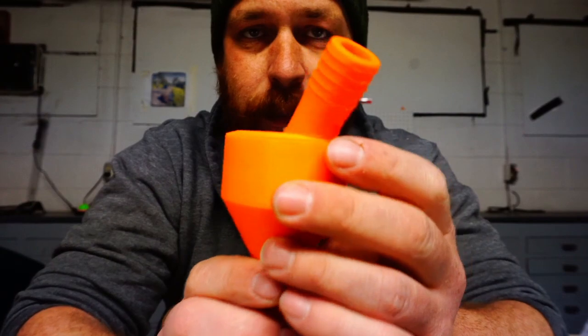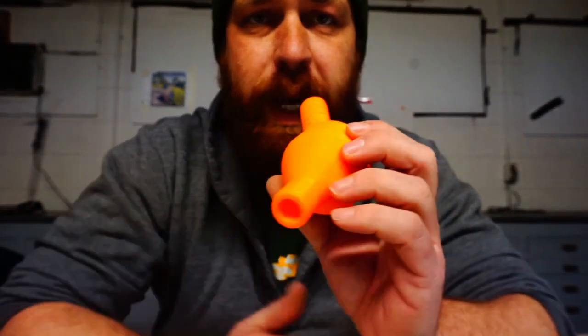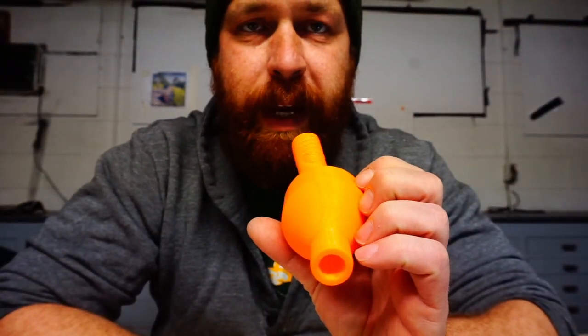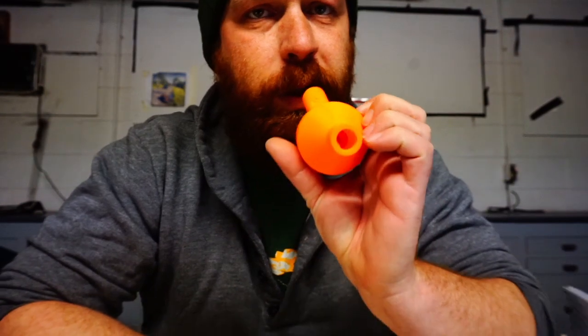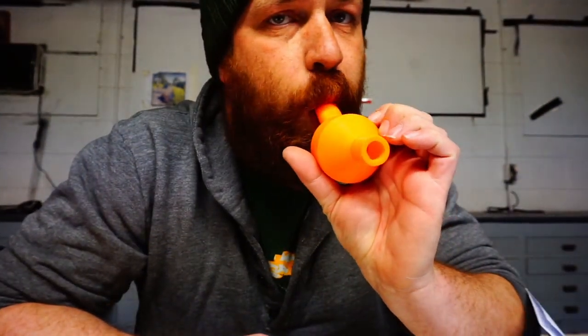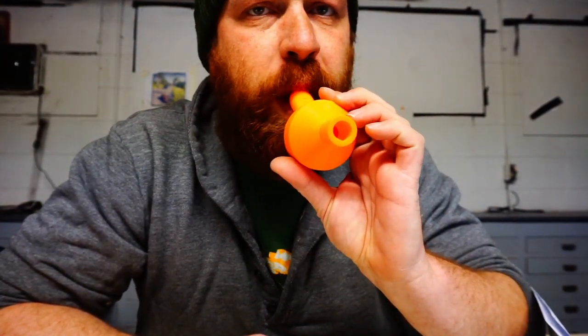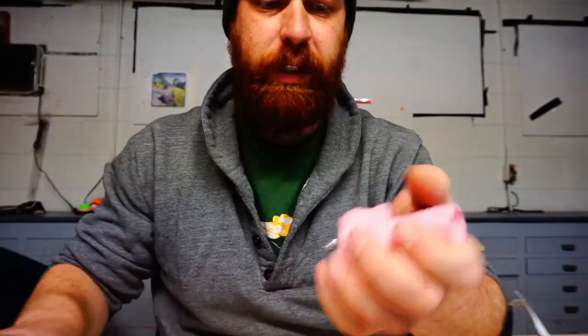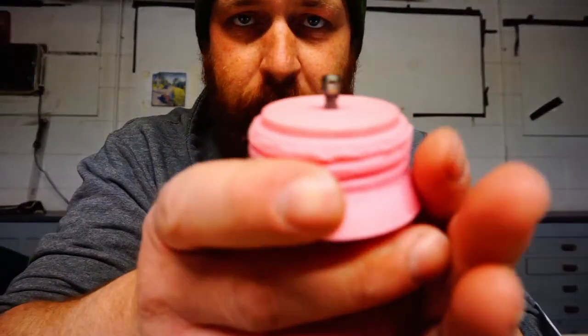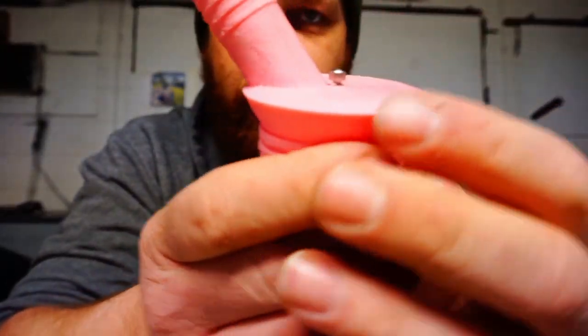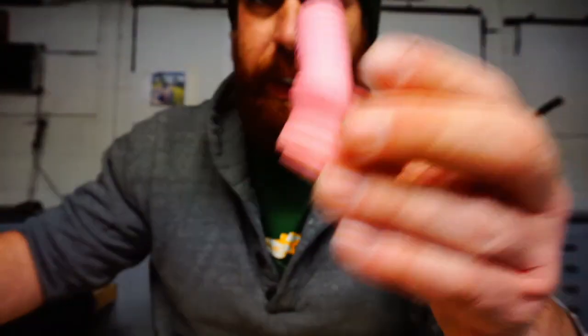Now on to the PEEP valve that I made. So this valve will allow you to exhale, but at a certain low pressure it will close. So at a very low pressure, it is closed. At a higher pressure, you can blow through it with some resistance. The mechanism that it's using, here's an earlier bad prototype, is this top piece.